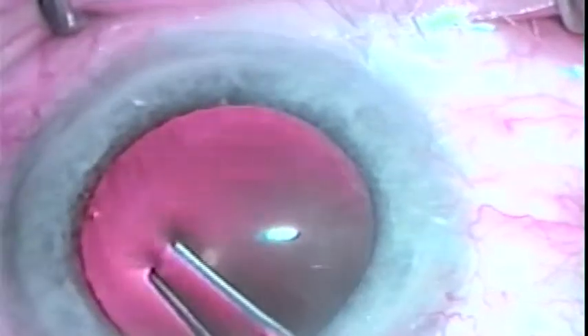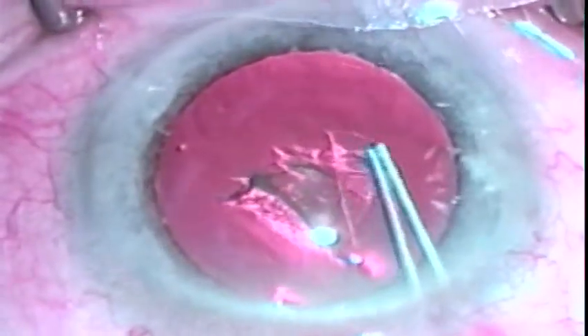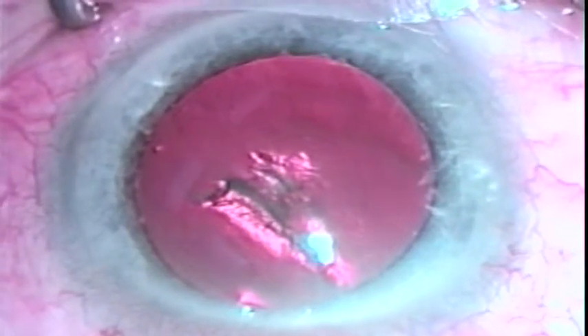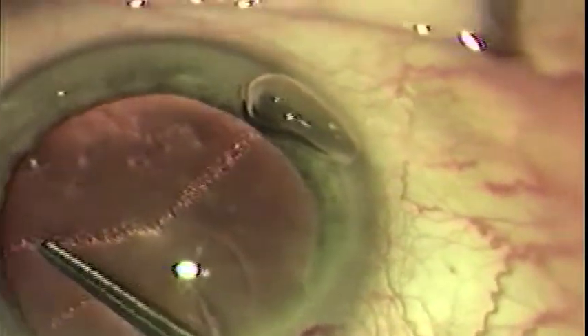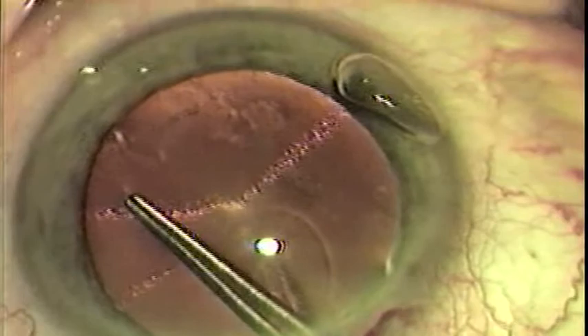In several hundred cases, I have found this single instrument to be superior to available cystotomes and other forms of capsular forceps in allowing more delicate control in both initiating as well as directing the capsular tear. The convenience of having one instrument replacing several should enable surgeons to more readily master the techniques of capsular rexis.